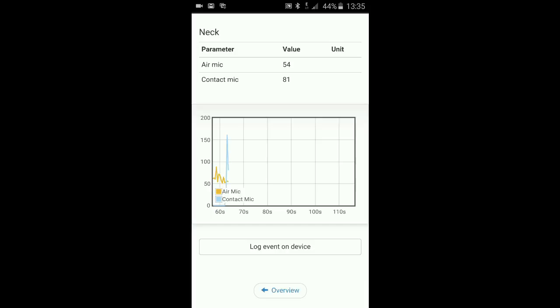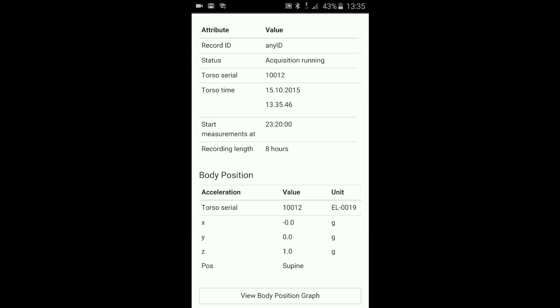So contact microphone is reacting. You see the blue line. The airborne reacts to some airborne noise. Back to the overview.